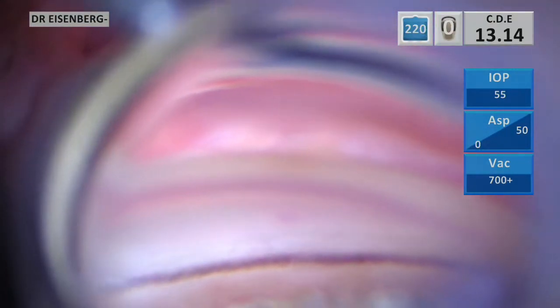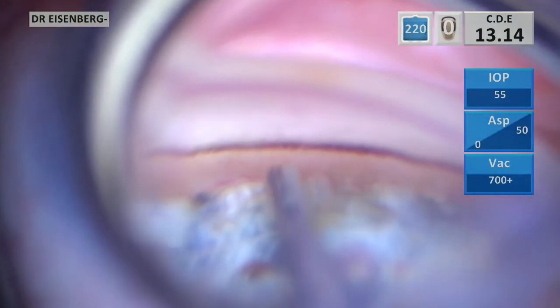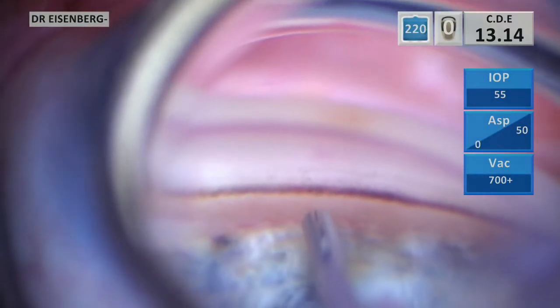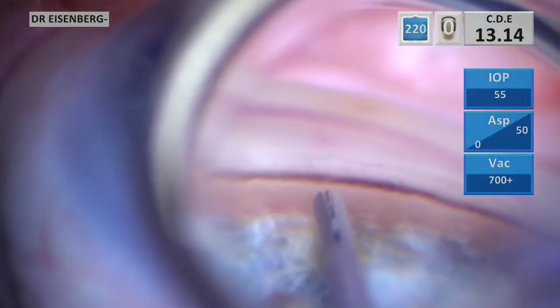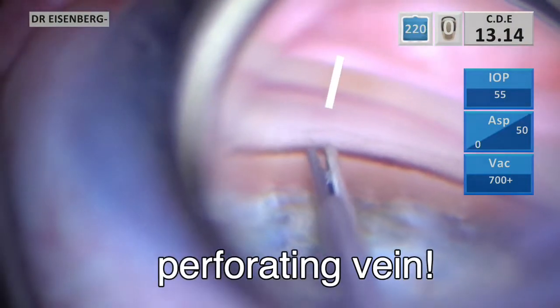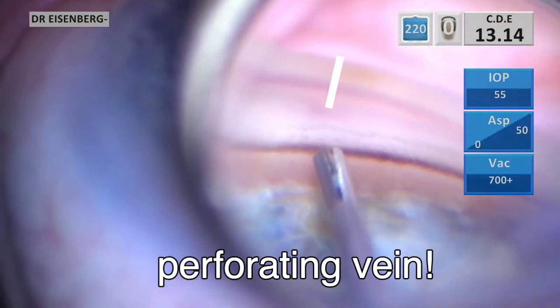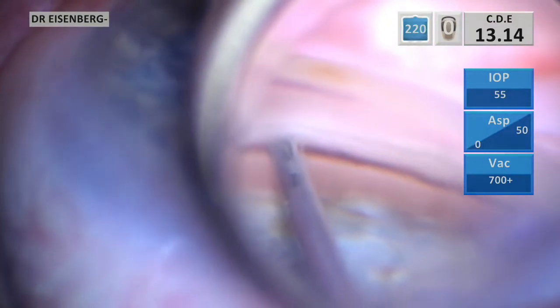And here we go. I'm working to get just the right angle on the approach. Again, beautiful highlighted TM with pigment. Scleral spur, very well visualized. And there's something interesting there — take a look at that little red shadow up there. That is a perforating vein. So I'm going to try and put this stent right below that perforating vein.